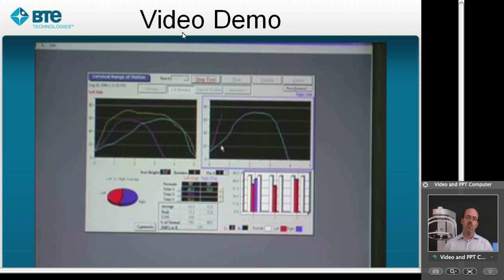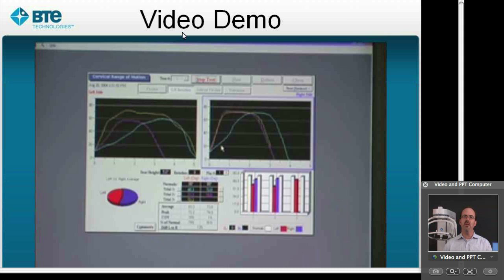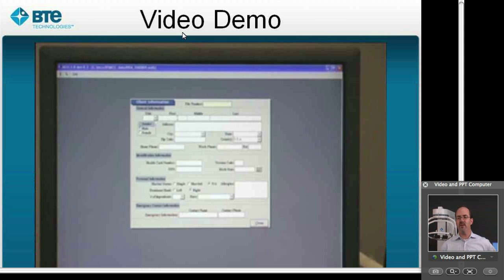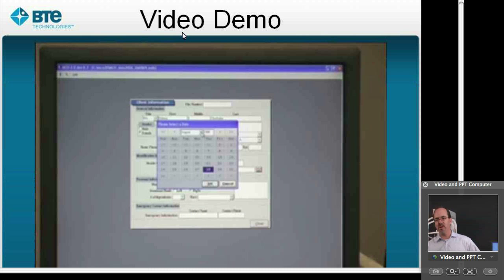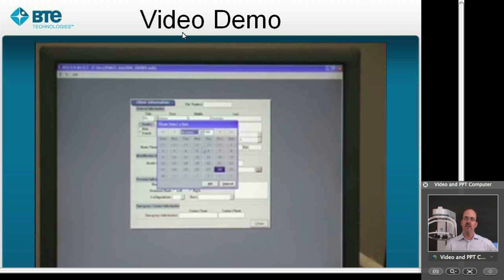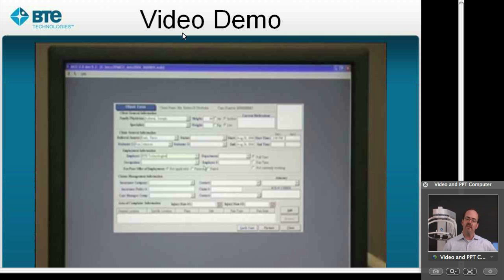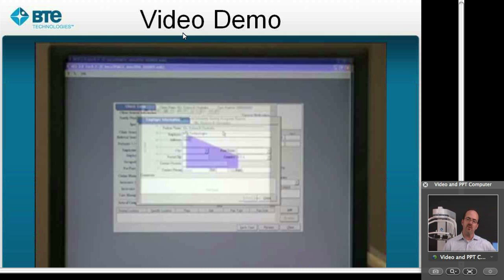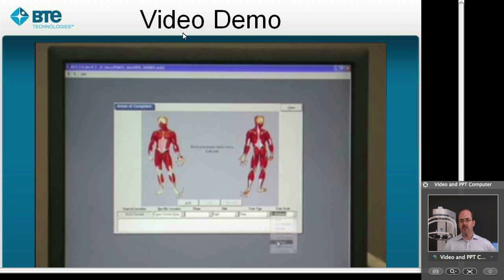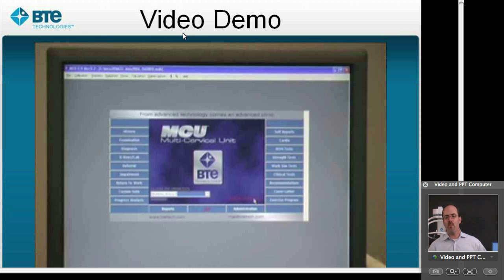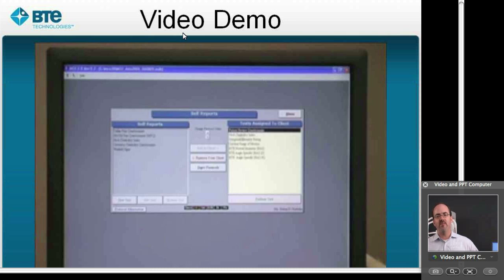The software is calculating the averages, the peaks, and taking the coefficients of variation so we can look at consistencies for the client. Here we've got a video of entering the client information into the system — creating their profile so that we can save the data and report on their progress. Whether it's selecting from anatomy, creating a problem list to address, or using a preloaded protocol such as the Melbourne Protocol, it's a great way to help a clinician get started as soon as the system hits the door.